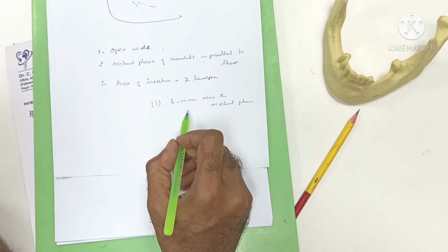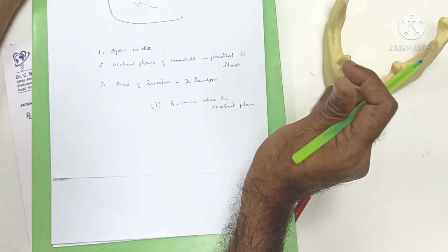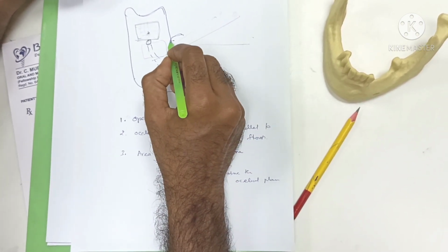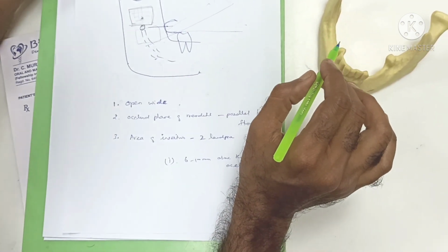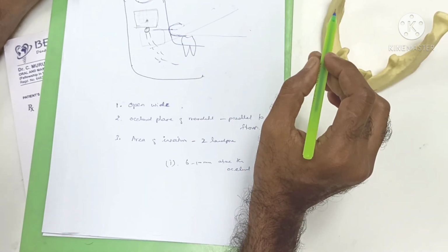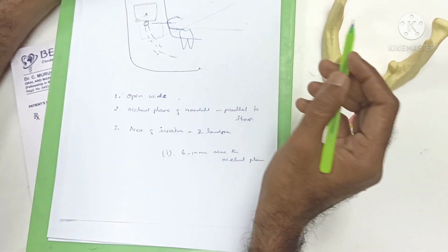Theoretically, how it is determined is, you might have read in textbooks, you have to keep your finger in this notch and the middle point of your finger should be the point of entry. But some doctors may have a small finger, some people have a big finger, and you may have error in this. The general rule is you don't have to follow this finger rule at all.